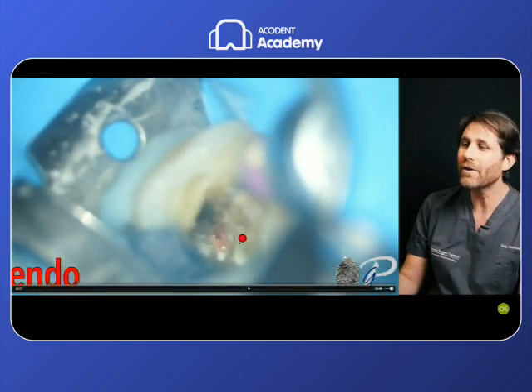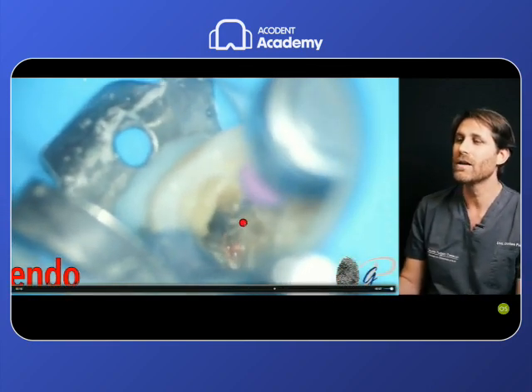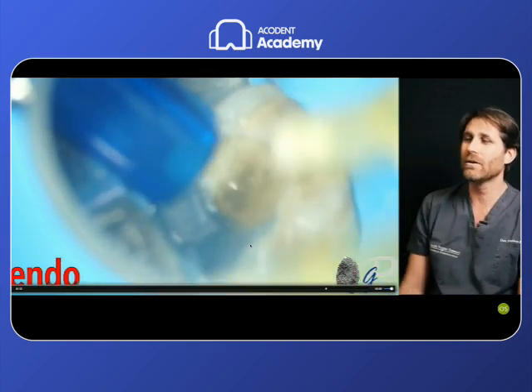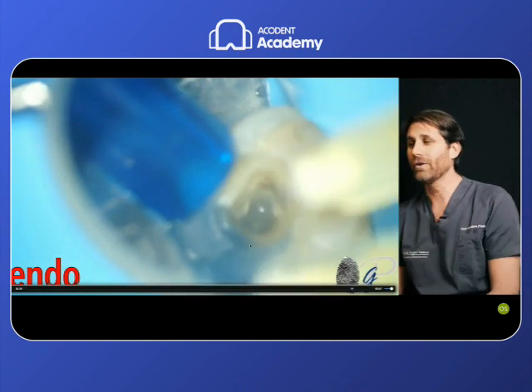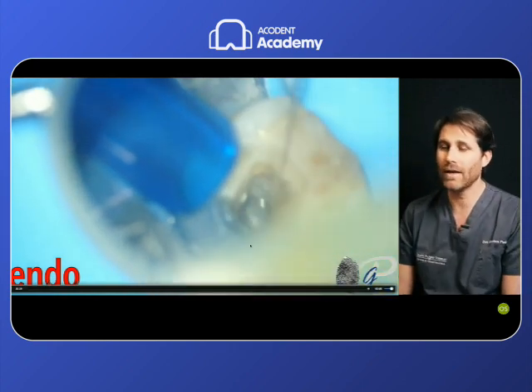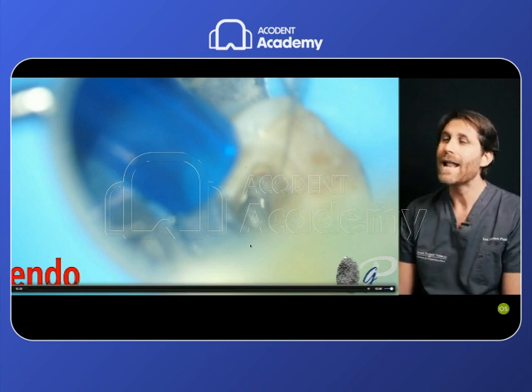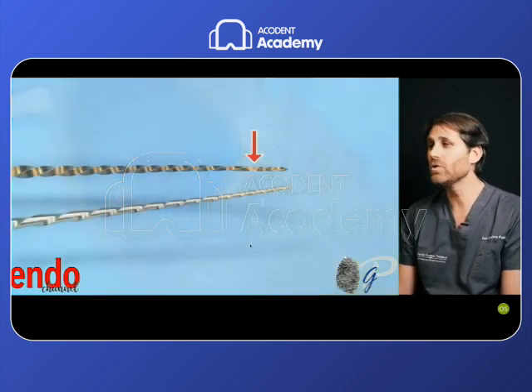And look, after removing all the calcification, we reached the apical third where bleeding pulp was found after the calcification. And this is the work that the AirPilot does and the other instruments are not able to do. And this is the picture of the instrument that I used after this.